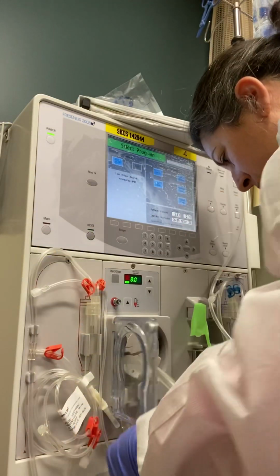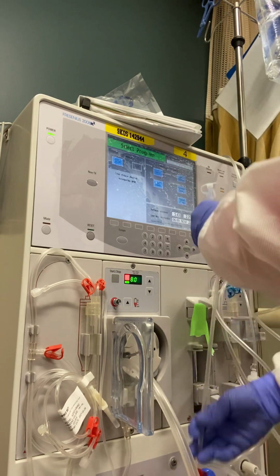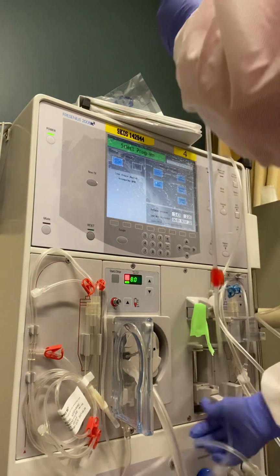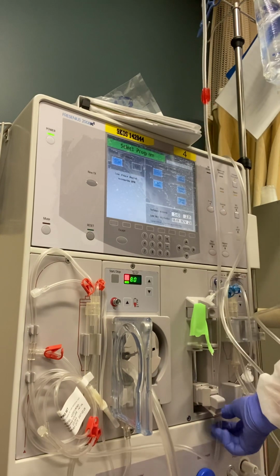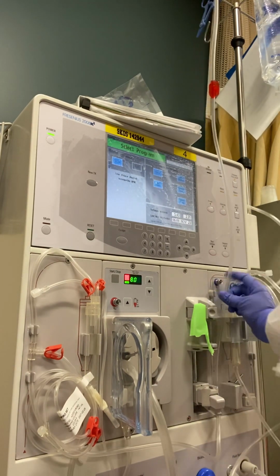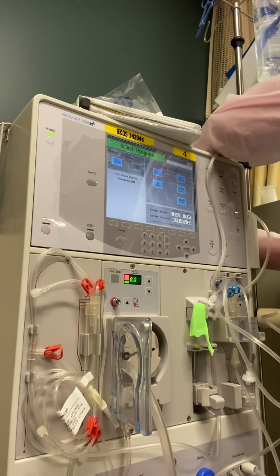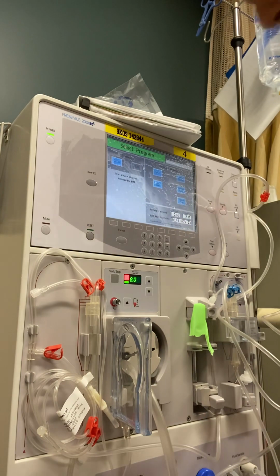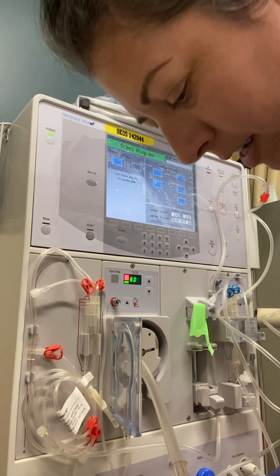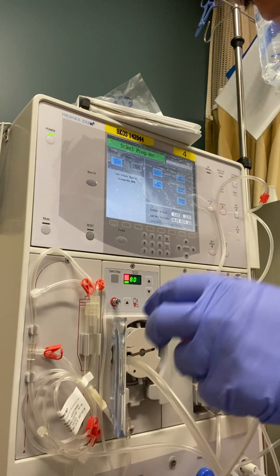I like to come through here. And the dialyzer line, I'm going to connect to the bottom of the dialyzer.